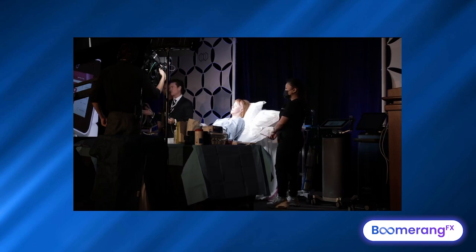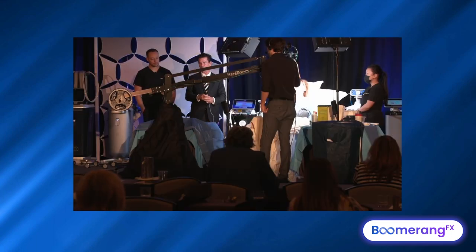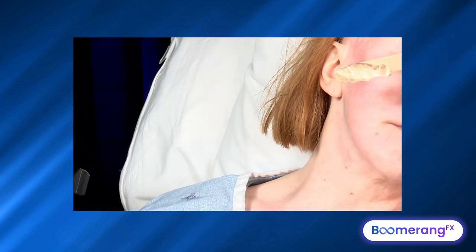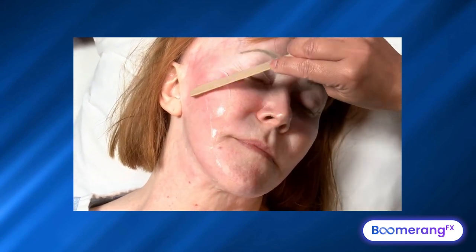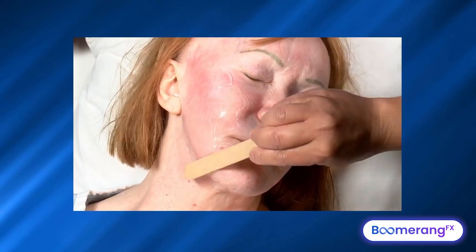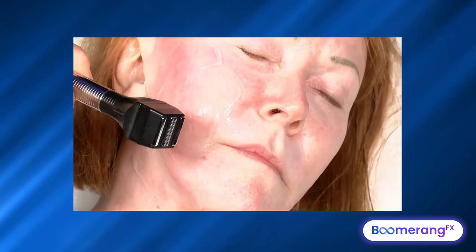We'd like to be 45 degrees, but that would be way too long — 45 minutes on one side of the face and another 45 in the brow. So we add a bulk heating ultrasound gel, like we did with the photofacial. We don't need to protect our eyes this time because this is RF, not optical. And we put our foot on the pedal.